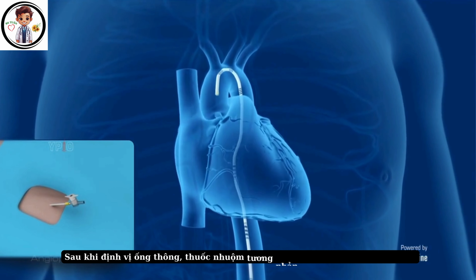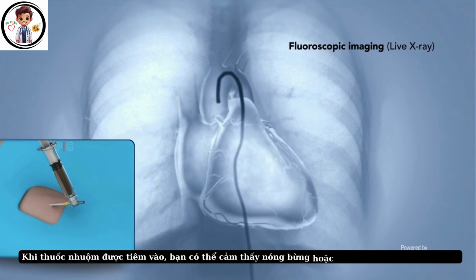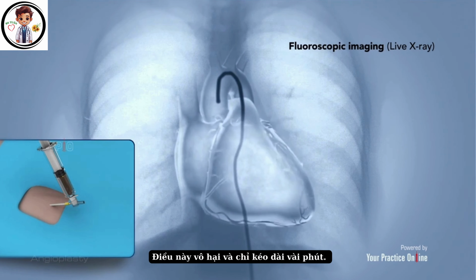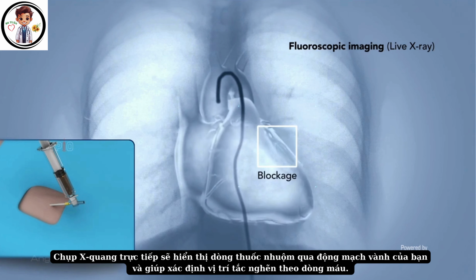After positioning the catheter, a contrast dye is injected into it. When the dye reaches your bloodstream, you may experience a brief flushing sensation or warmth. This is harmless and lasts only a few minutes. The live X-ray displays the flow of dye through your arteries and helps identify the blockages in the blood flow.